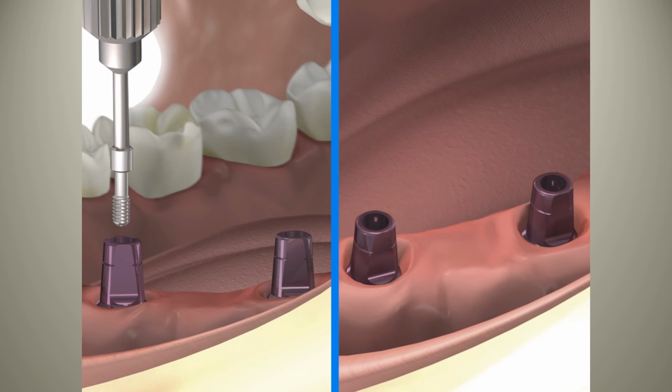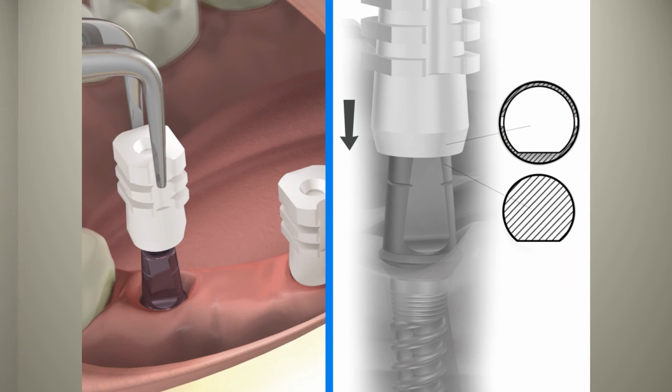And as you can see from the picture on the right, splinting these together is not going to be quite as logical as you're going to see later on when we talk about splinting the impression copings for an open tray technique. You also want to take a radiograph to ensure that these copings are seated in the appropriate spot. On these copings, you can then place these impression plugs, which sit down and have an intimate fit. Once again, I'd recommend taking a radiograph to ensure that these things are seated in the appropriate spot.